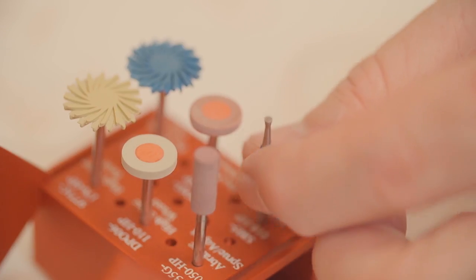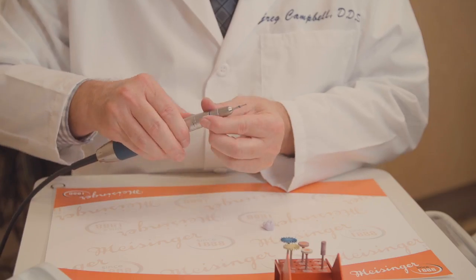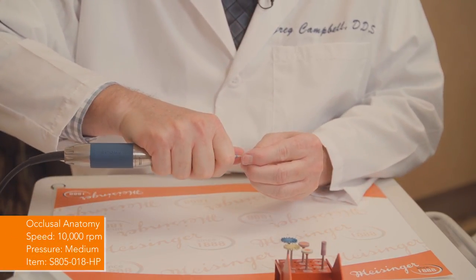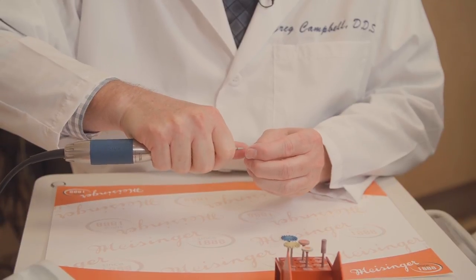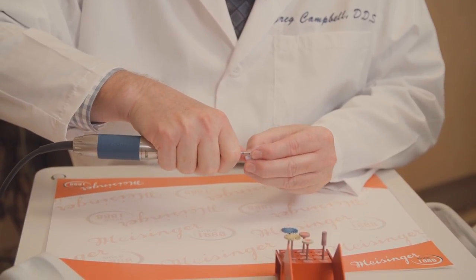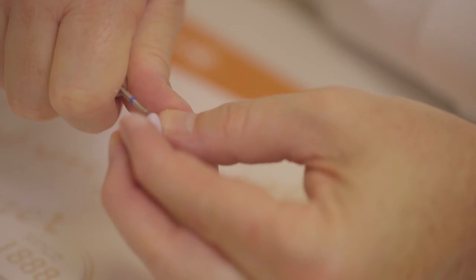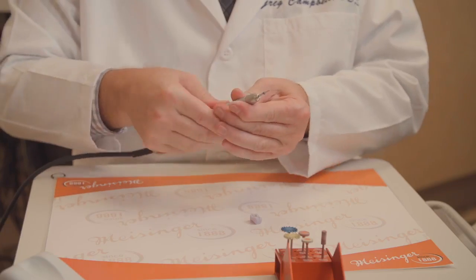The next thing I have is a centered cone. The centered cone allows us to define or refine any anatomy, extra anatomy we'd like to put in on this. I tend to like to accentuate my grooves. I tend to like to make sure that I have a great primary and secondary anatomy here. So I'm going through here, I'm actually putting in my extra anatomy on here. This is going to last you a very, very long time.